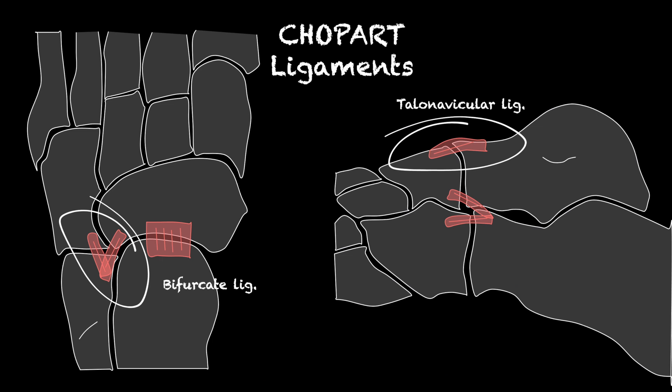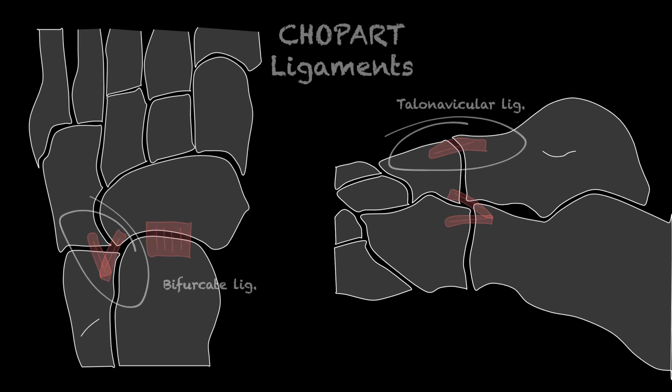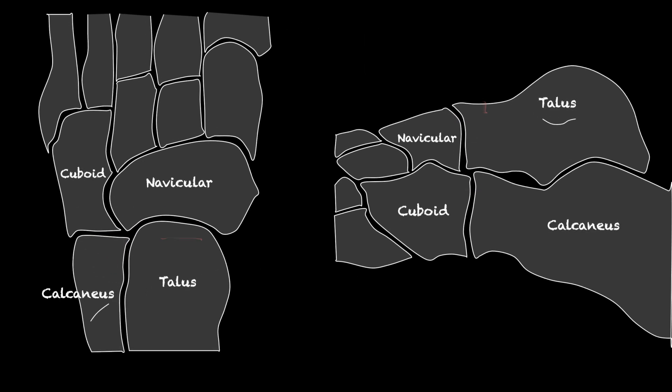The ligaments of the Chopart joint include the talonavicular ligament, bifurcate ligament, as well as the dorsal lateral calcaneo cuboid ligament, spring ligament, and the long and short plantar ligaments. But from a pragmatic perspective and from an ultrasound point of view, assessment of the talonavicular and bifurcate ligaments is a must.